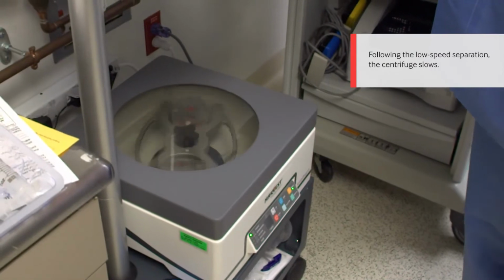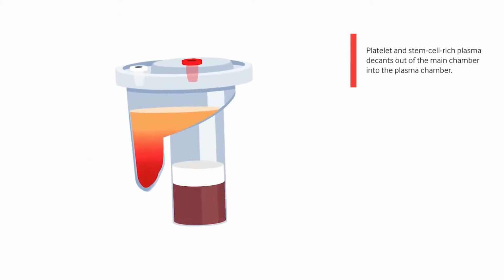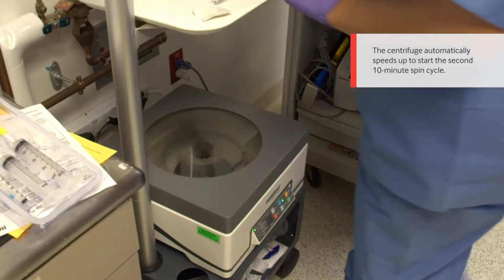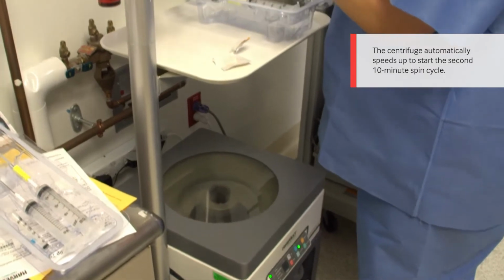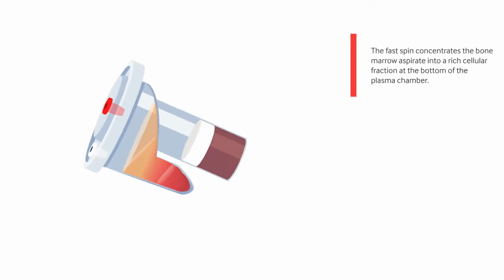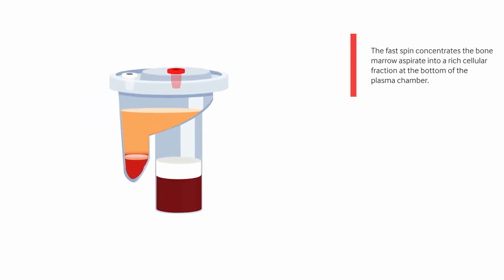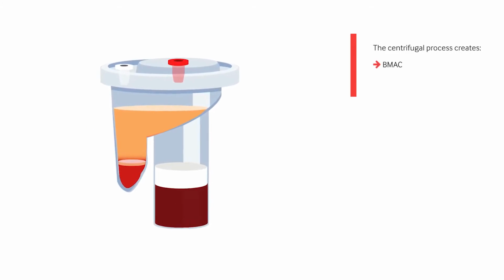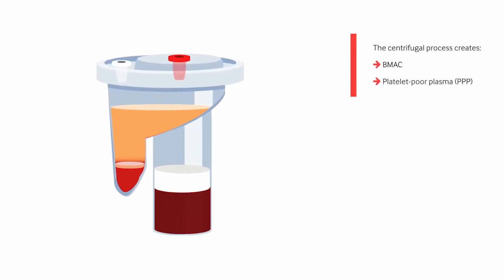Following the low-speed separation, the centrifuge slows. Platelet and stem cell-rich plasma decants into the plasma chamber. Once finished, the centrifuge automatically speeds up to start the second 10-minute spin cycle. This fast spin concentrates the bone marrow aspirate into a rich cellular fraction at the bottom of the plasma chamber. When the system stops, the result is 4 to 20 milliliters of concentrated bone marrow aspirate.